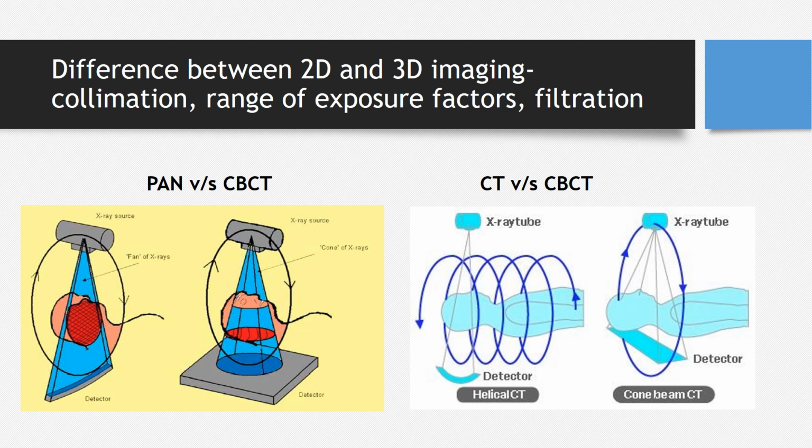It is best suited for the head and neck region because of its ease, convenience, as well as availability and other factors which we will discuss. So there is a difference in the collimation, the range of exposure factors, and filtration as well.